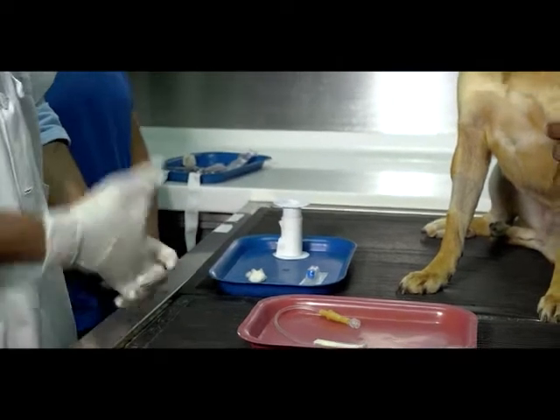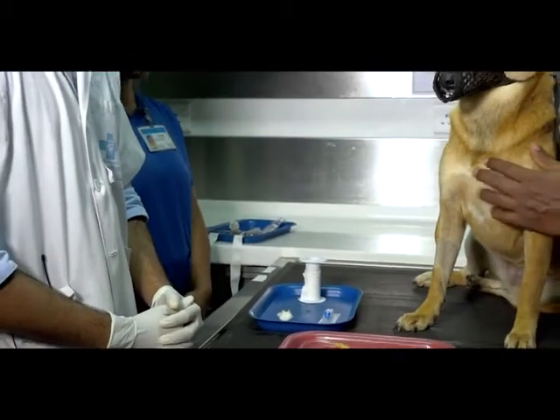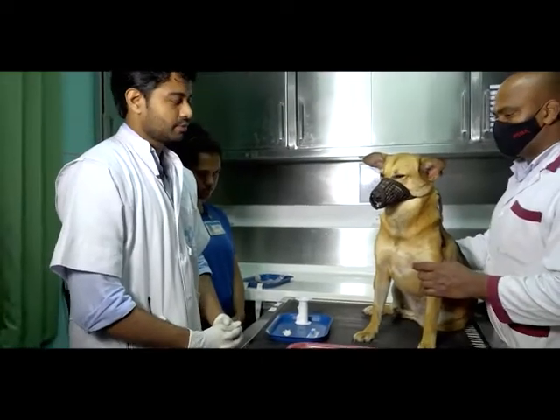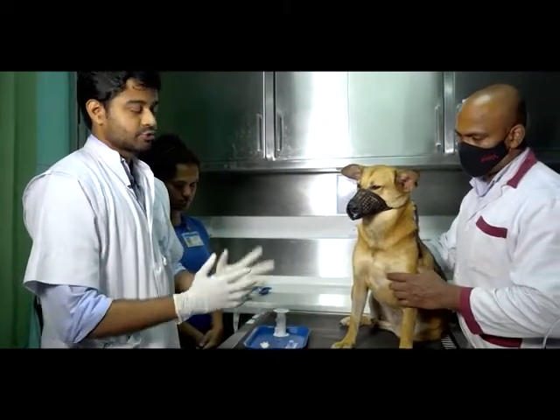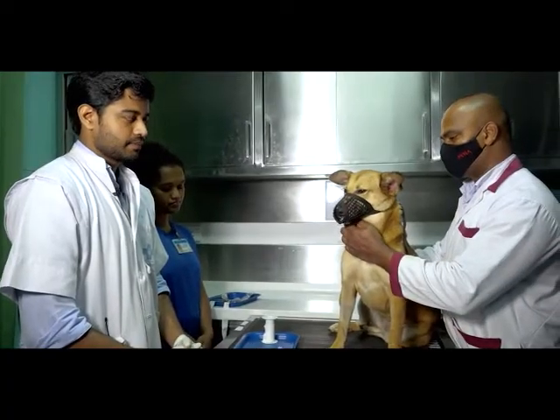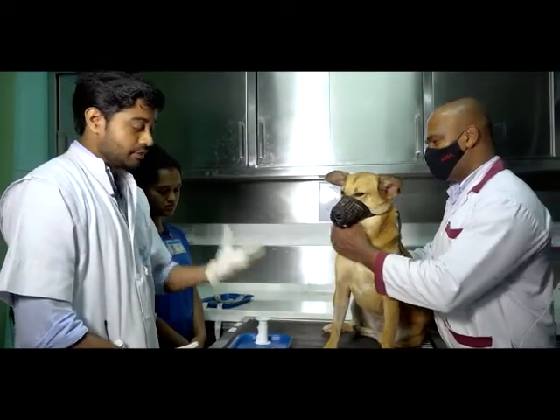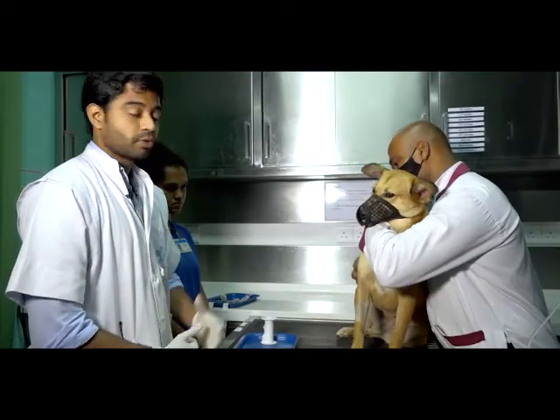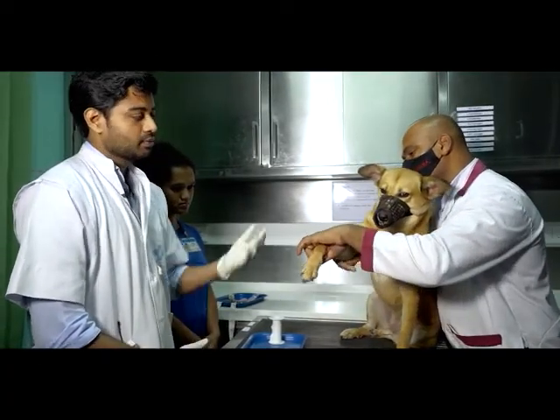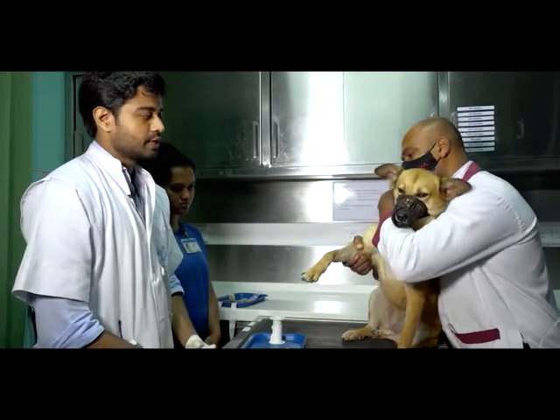Well, Harmina is ready with the muzzle for the IV catheter, and for IV catheter it's important that we restrain the patient well, because if it's not going to be proper restraining, placement of the IV catheter would be difficult. But Harmina is quite used to this position, so we're going to hold her like this.